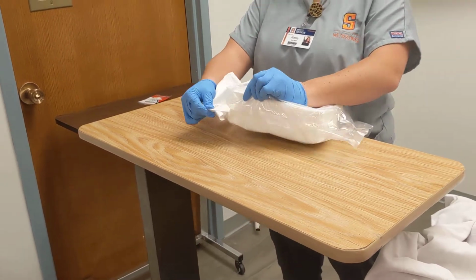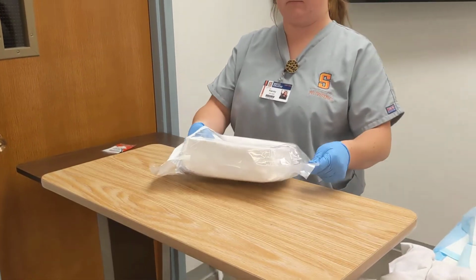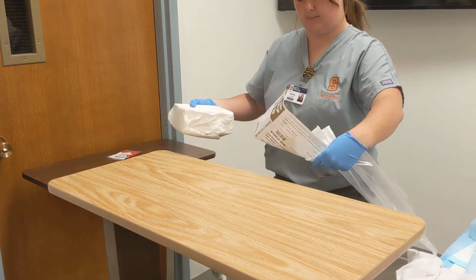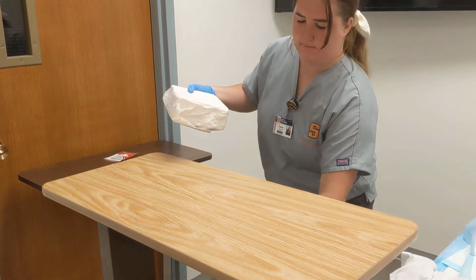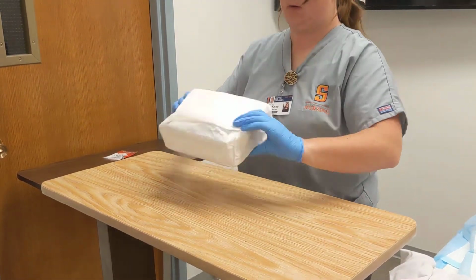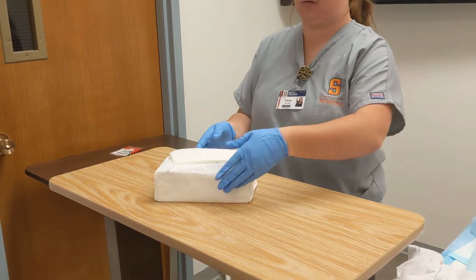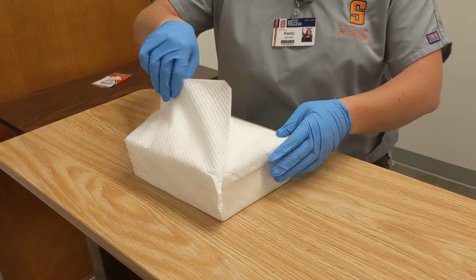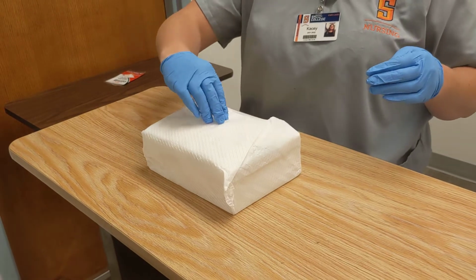Okay, so we're gonna just pull this out. Put that in the garbage. Okay, so now we're gonna open our kit up, and we're gonna be using sterile technique.